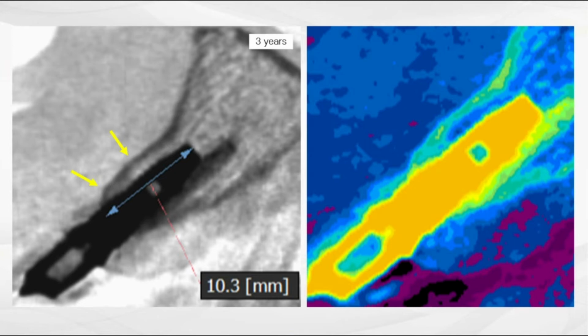If you see the right-hand enlarged photos, you will see the slight difference in color between the regenerated cancellous bone after ridge augmentation and the former cancellous bone in cortical bone. In other words, the regenerated cancellous bone is still in the remodeling transition process to normal cancellous bone with the function of the dental implant.